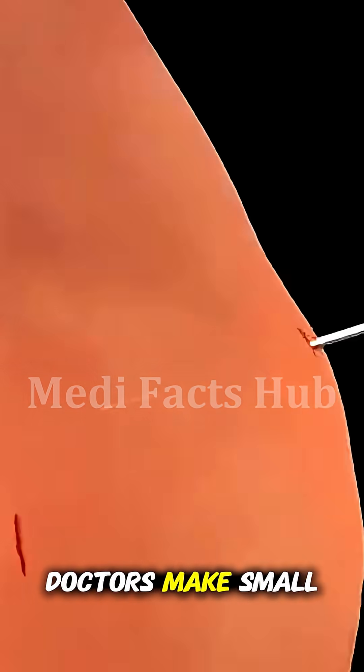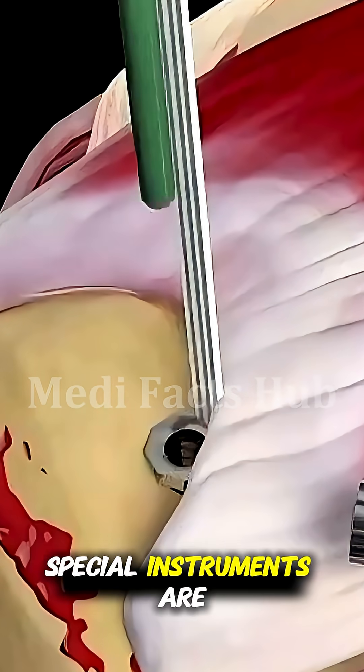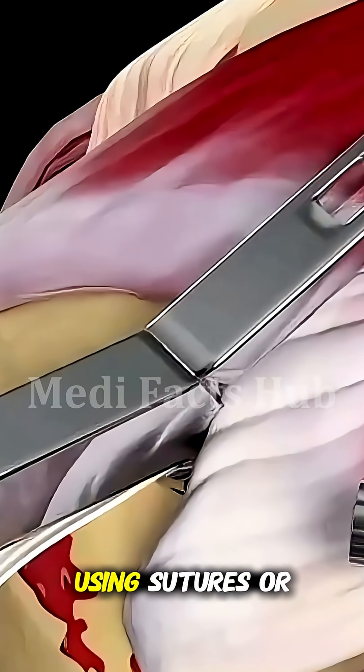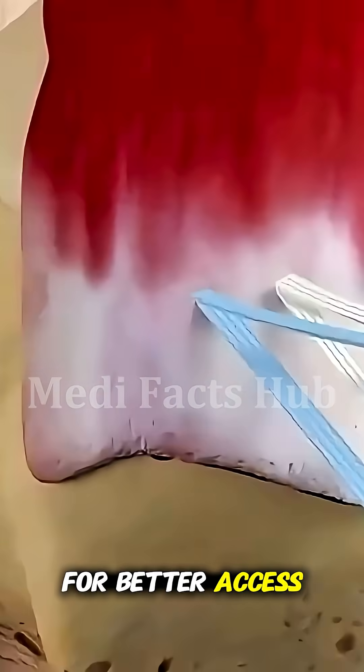During the surgery, doctors make small incisions and use a camera called an arthroscope to see inside the joint. Through these tiny openings, special instruments are used to clean damaged tissue and reattach the torn tendon to the bone using sutures or small metal anchors. Sometimes, larger tears require open surgery for better access and stronger repair.